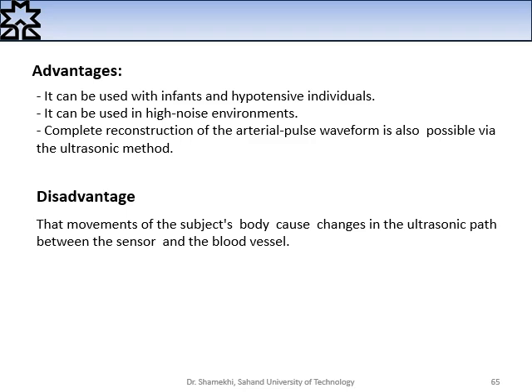But movements of the subject's body cause change in the ultrasonic path between the sensor and the blood vessel. This problem will affect the readings, and some inaccurate values may be recorded by the system.